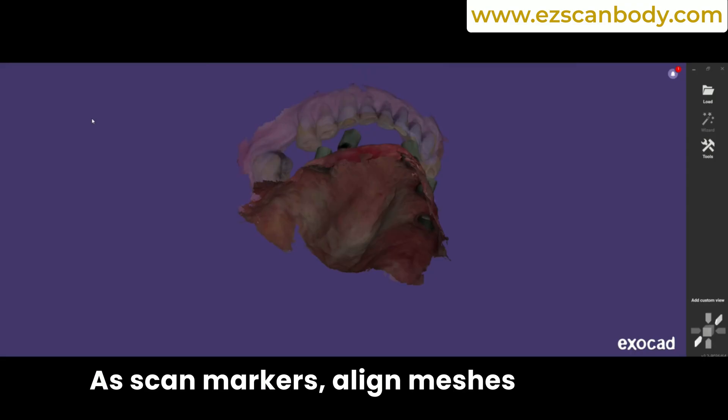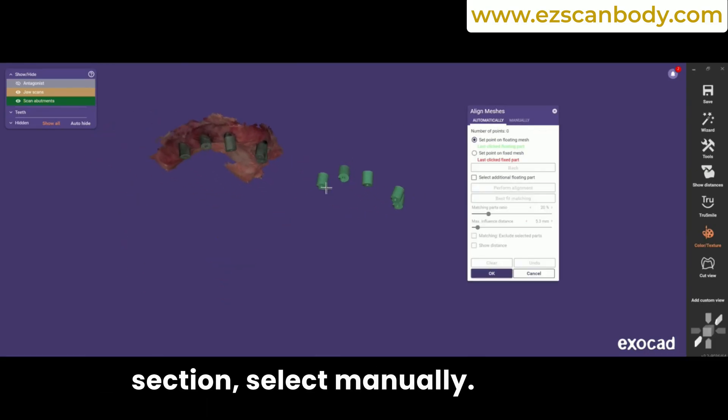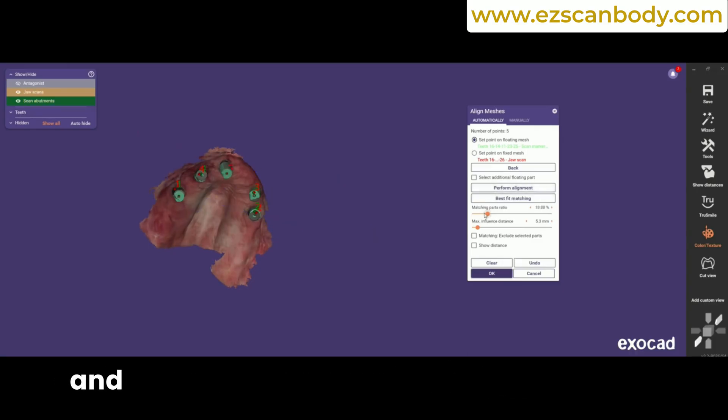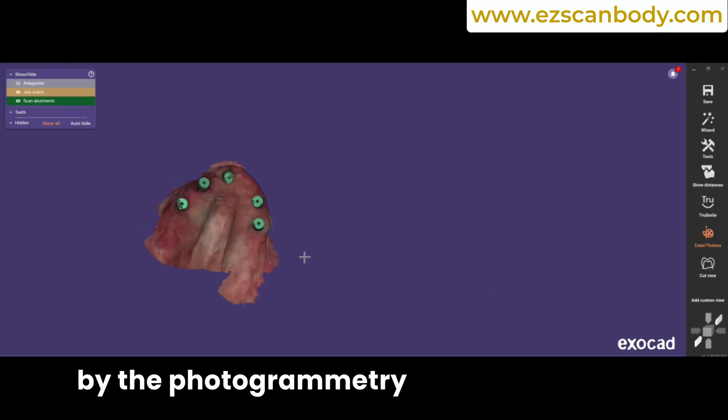Align meshes in expert mode. In the Meshes menu, under the Tools section, select Manually first. Bring the two meshes close to better visualize their positions. Then click on Automatically and identify three matching spots on the H-CAP in the model and the H-CAPs captured by the photogrammetry camera.